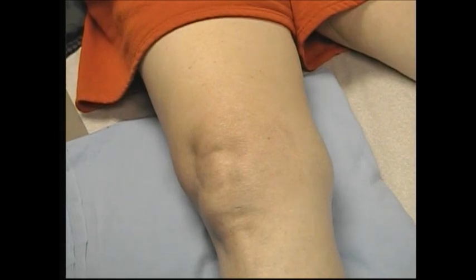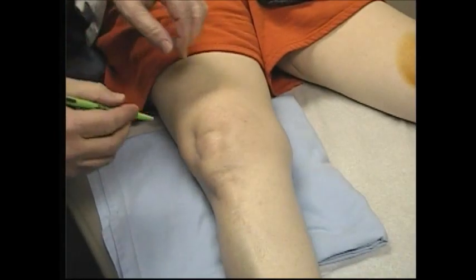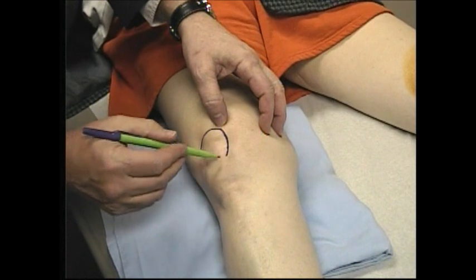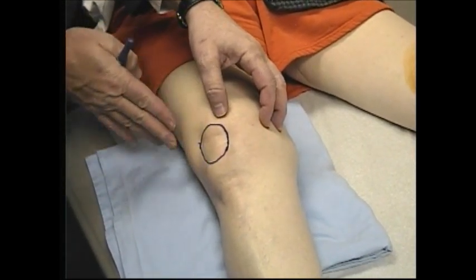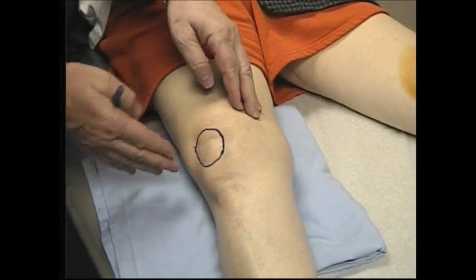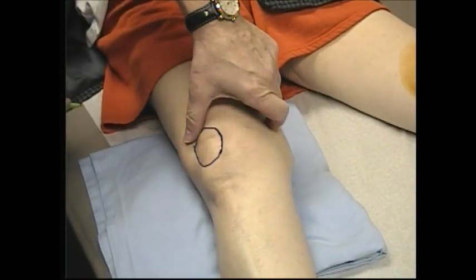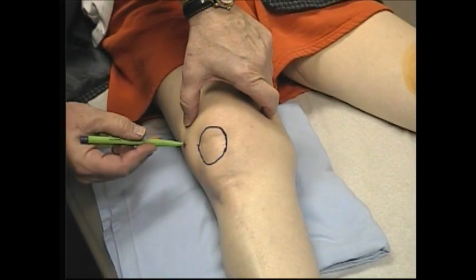So we'll mark this and then we'll aspirate from the lateral side. We're going to mark the knee. I'm going to palpate for the patella, which is here. Once we mark the patella, you can see how swollen the lateral side is. We feel that's a fairly fluid feel, so it's right around 3-plus. It's not tense, which is what I intend for a 4-plus. So we'll come about one thumb's breadth up and one thumb's breadth over, and we'll aspirate basically right in this area.